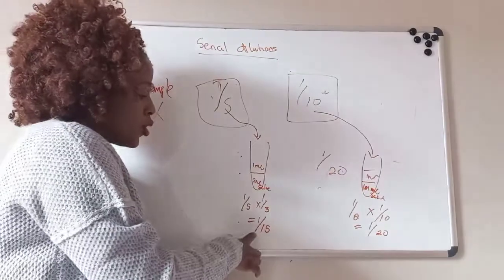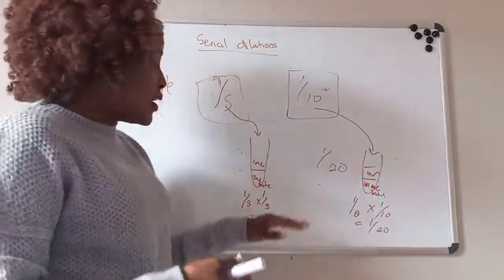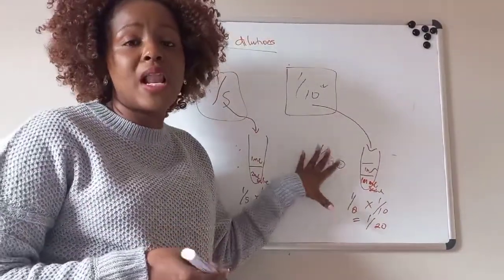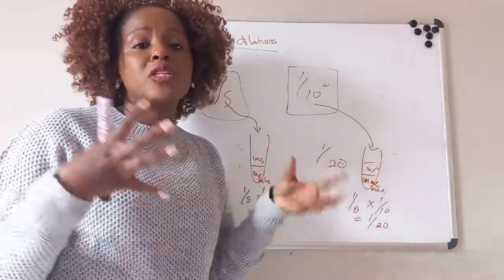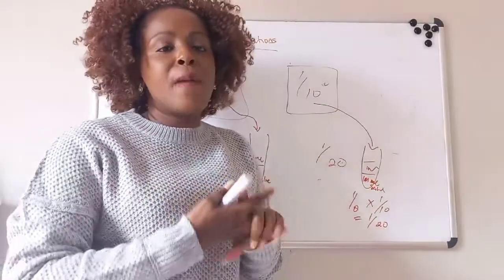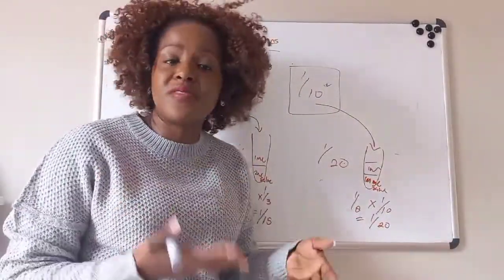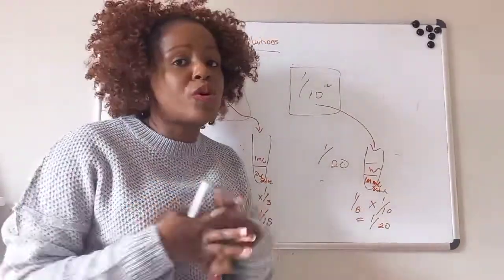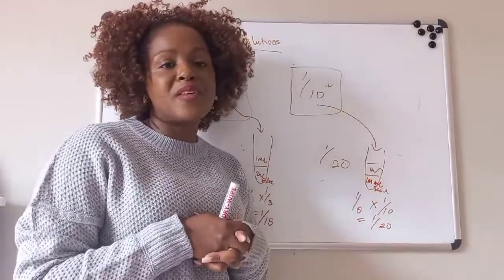In this case, you'll only have to ask for a repeat if, after you have made these dilutions, your percentage difference does not fall within the total allowable error. That's when you can ask for a repeat. But if it falls in, you would have saved a lot of time. You have saved the baby the pain from the blood being drawn and so on, and you are proactive. You manage to give out the result.